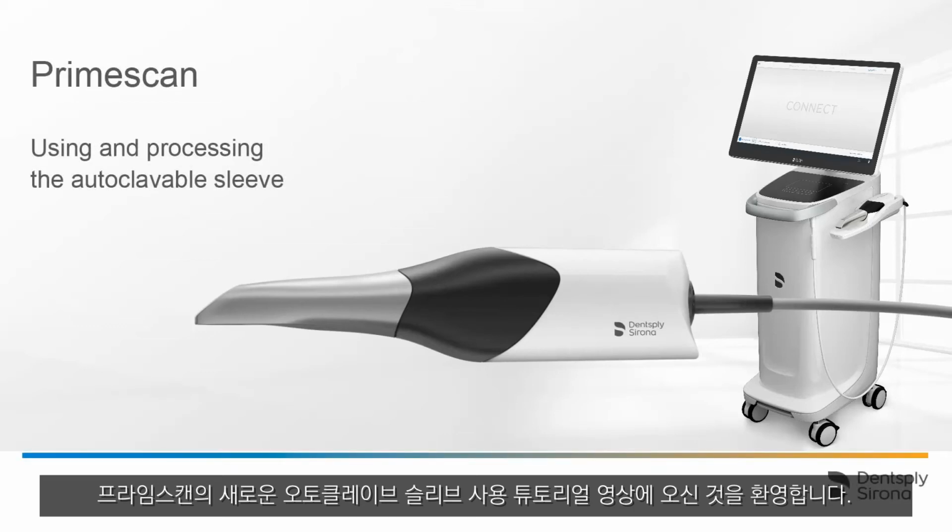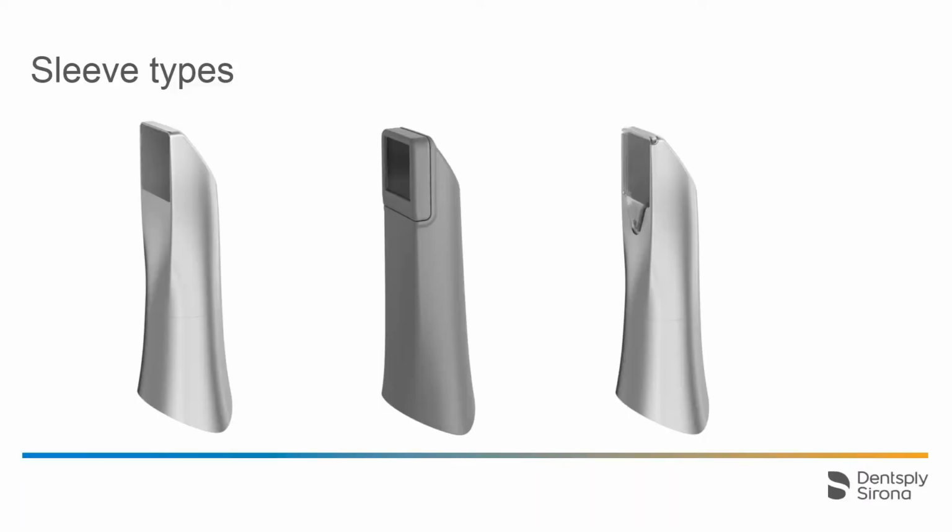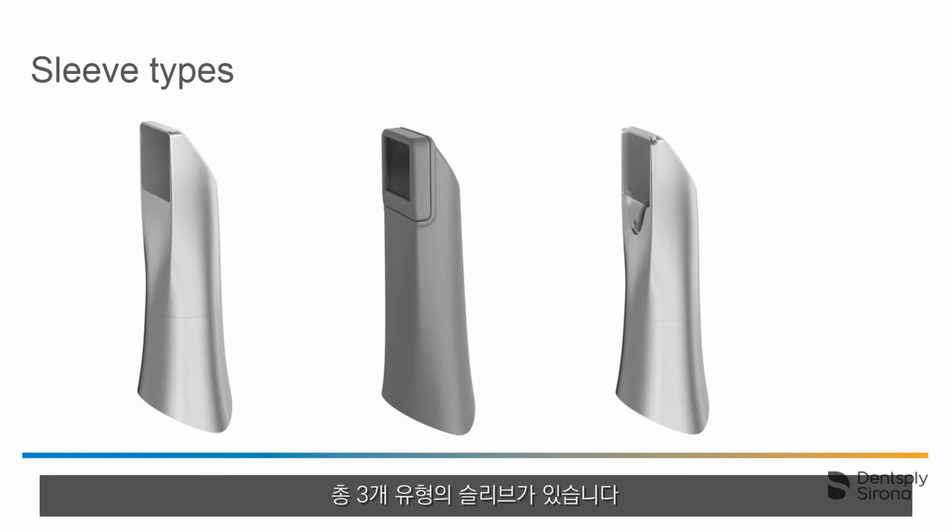Welcome to this video tutorial on the topic of Primescan and the new autoclavable sleeve. This video summarizes the steps of using and processing the autoclavable type sleeve. There are 3 different types of sleeves in total.